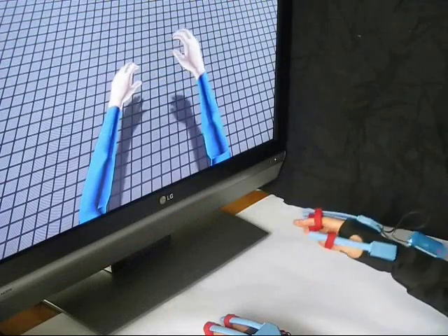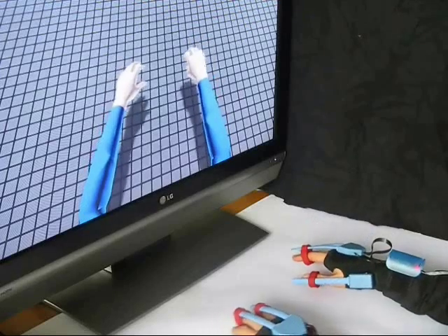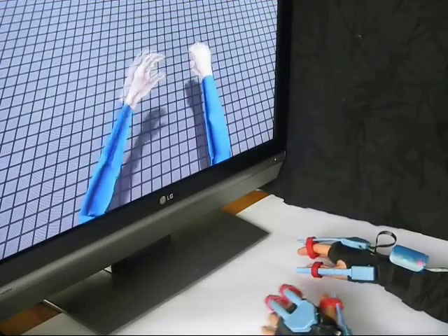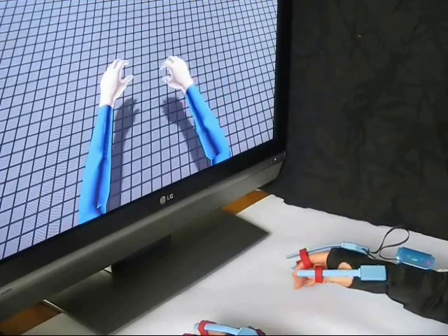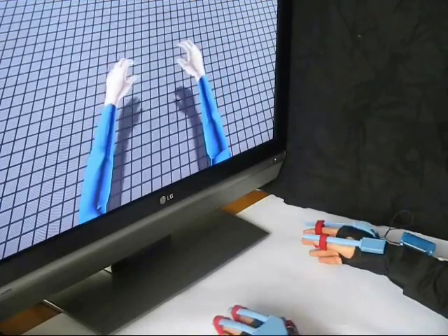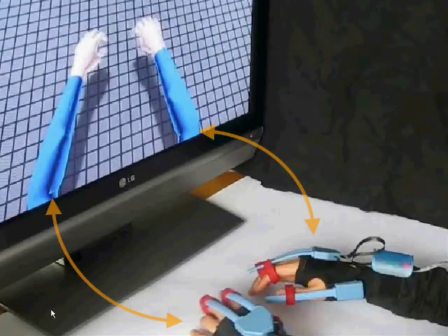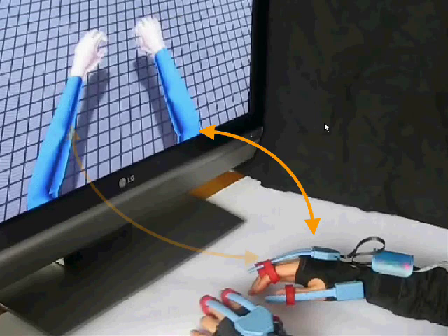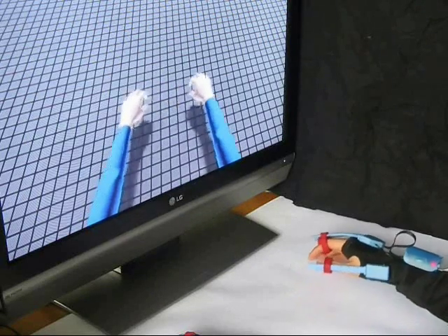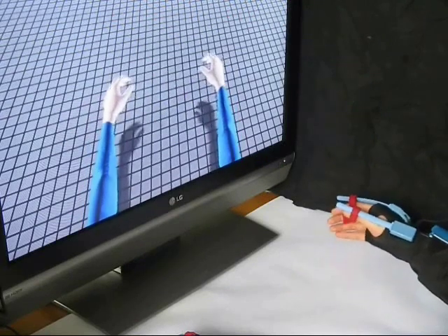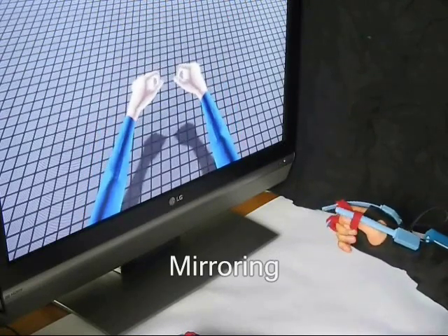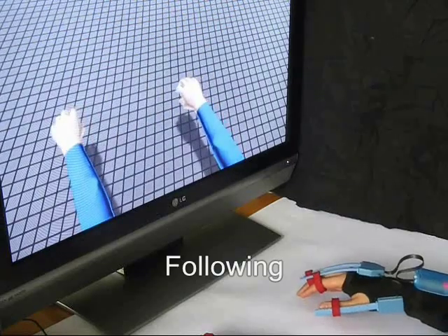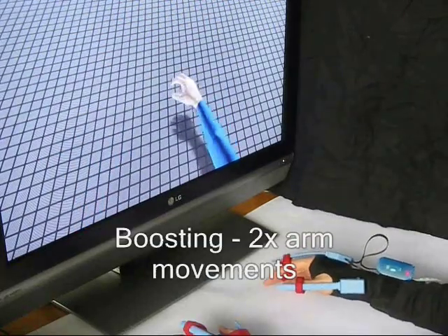Our virtual reality rehabilitation system is designed to maximally activate the mirror neuron system. Patients' real arm movements are mapped onto virtual arms in real time. If they cannot move one of their limbs due to a stroke, then the healthy limb can provide the necessary movements. Different mappings of the real to virtual arms can be implemented — for example, mirroring, following, and boosting.